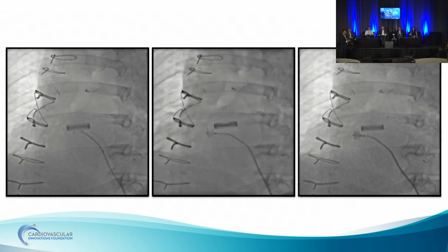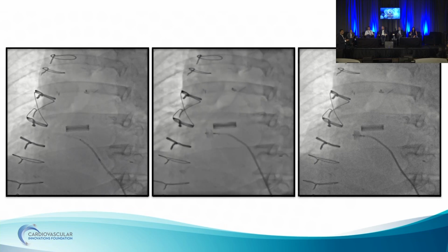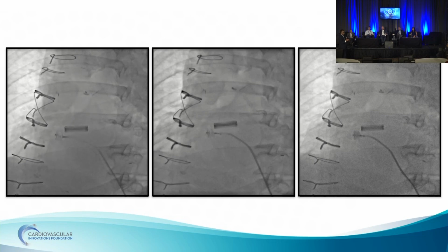So they went a little bit deeper with the catheter, and you'll see that in the first image on the left. They went deeper into the pseudoaneurysm space just to get a little bit more stability, and then were able to deliver the AVP2. So the middle picture is the first delivery, and you can see that all the discs are inside the pseudoaneurysm space. That's another important part of this: to make sure that there are discs inside, but also a disc outside so that you're actually closing it off.